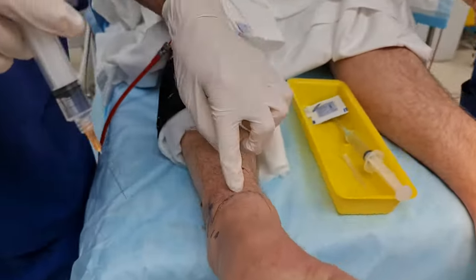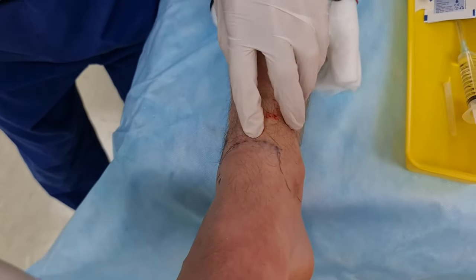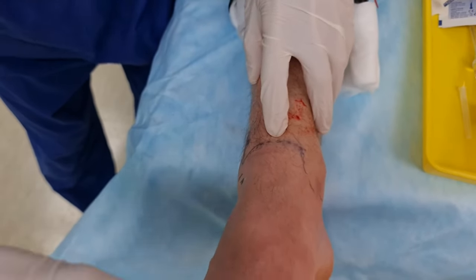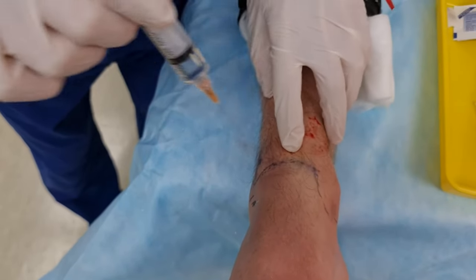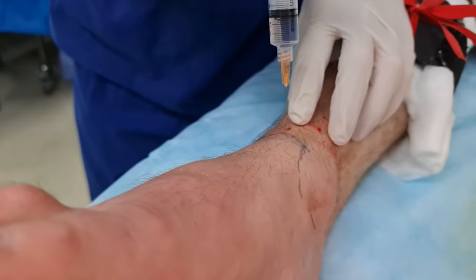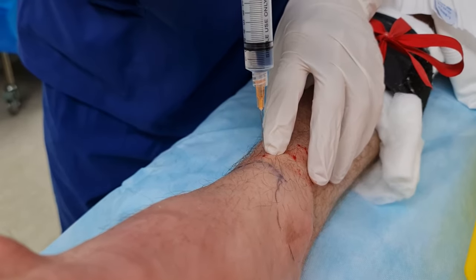Deep peroneal — okay. Deep peroneal is between your tibialis anterior and EHL. Give those a bit of a range of motion. It's coming about one finger breadth up from the tibia. You're going to go straight to bone, retract slightly, and that's your deep peroneal.